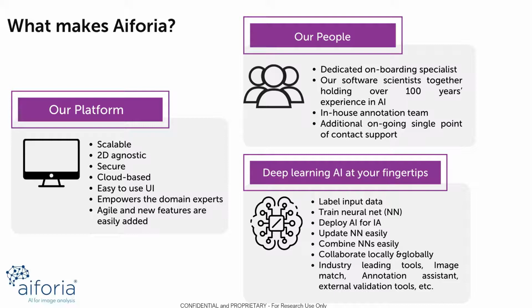So you'll never have to purchase any new equipment to be able to use our platform to build your AI models. We have been secure and cloud-based since our inception in 2013, so we're one of the longest-standing AI model development platforms to date. Really, our mission is to remove the most common barriers for researchers and clinicians in order to access AI as a research and diagnostic tool.